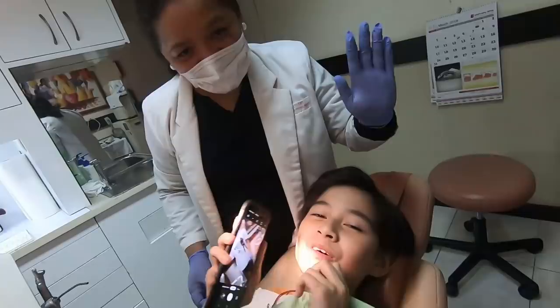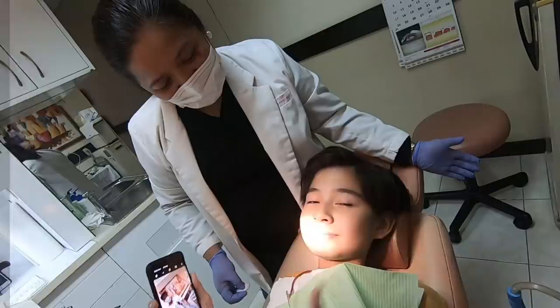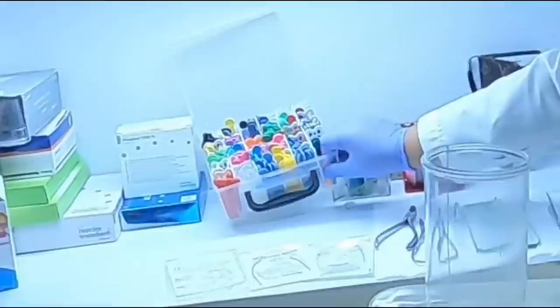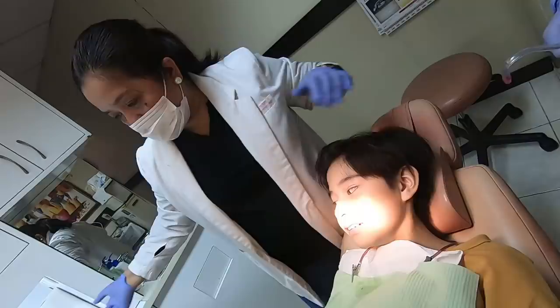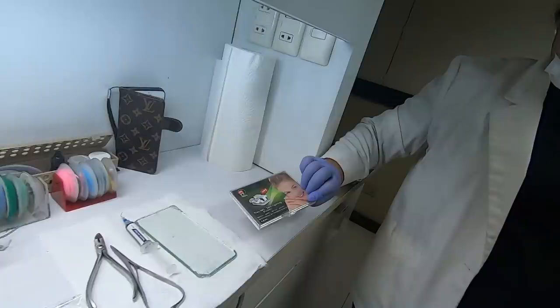Guys, this is Dokna, and she'll be the one who's putting the braces on me. She's using a self-ligating bracket. We also have the traditional one — the one with the collar like this — but for Kent, no need for this because we are putting the self-ligating bracket. This is more advanced than the traditional one.